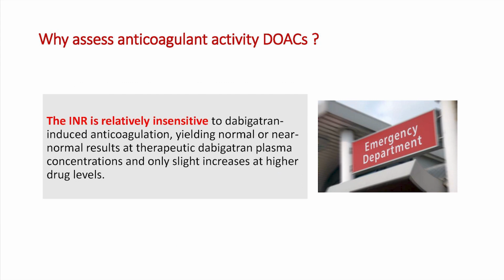Actually, the routinely available coagulation tests are not sensitive, like INR. INR is not considered a sensitive or useful way to assess the effect of these drugs.